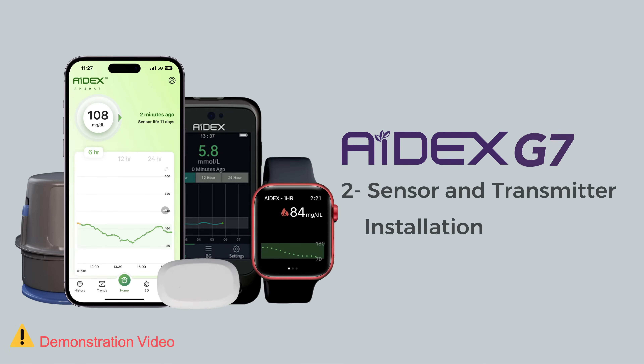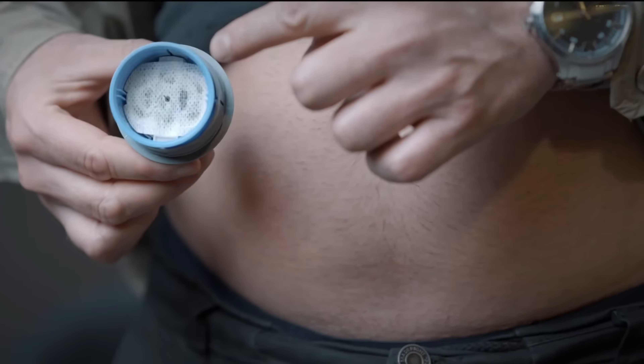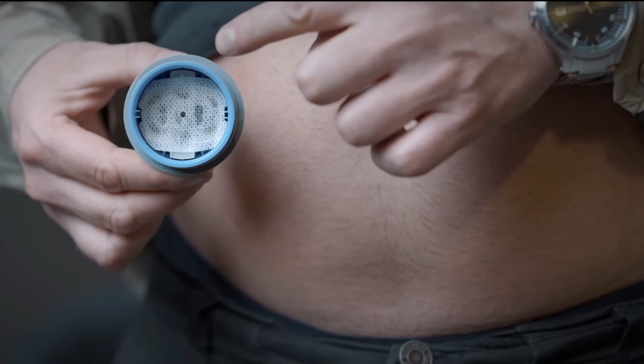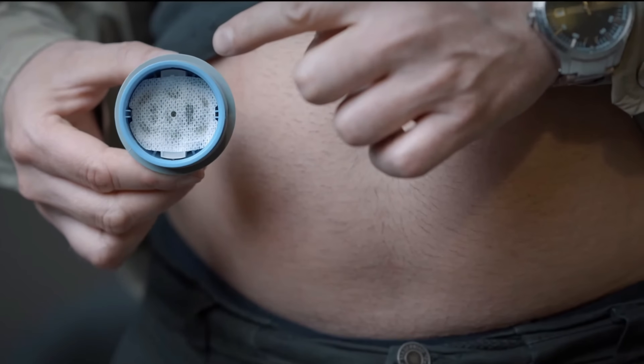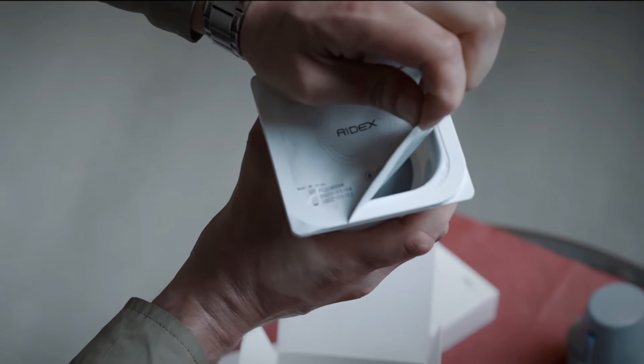Sensor and Transmitter Installation. The ADICS sensor is prefixed inside the sensor applicator, which assists in attaching the sensor to our body. Both of these components are stored within a sealed and sterilized package.